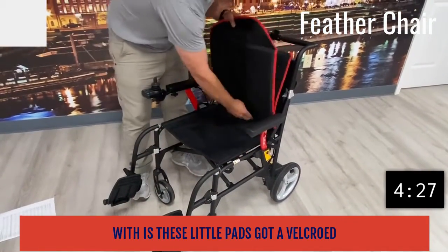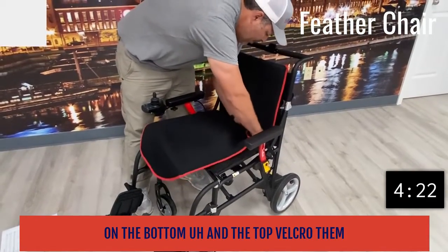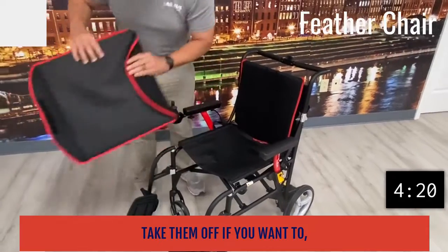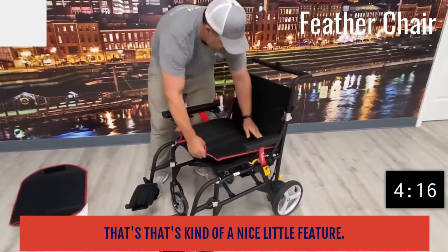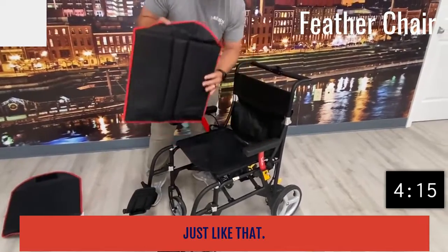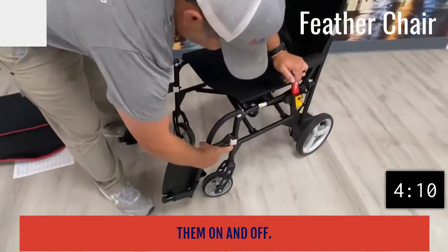One of the things it comes with is these little pads that are velcroed on the bottom and the top. You can velcro them on or take them off, and you can clean them just like that. Your leg rests are easy to handle when taking them on and off.